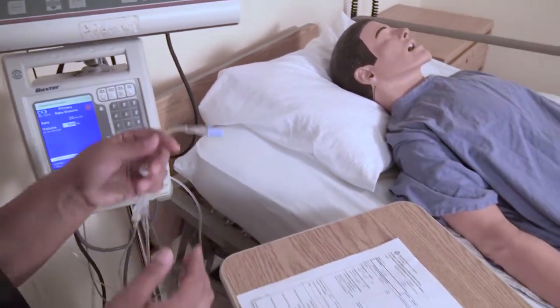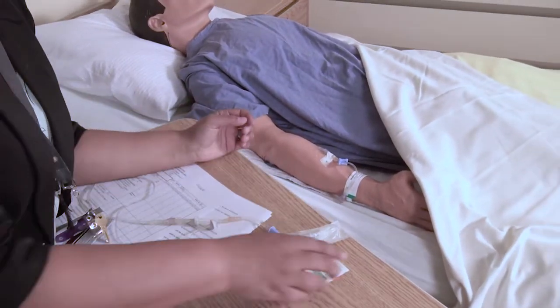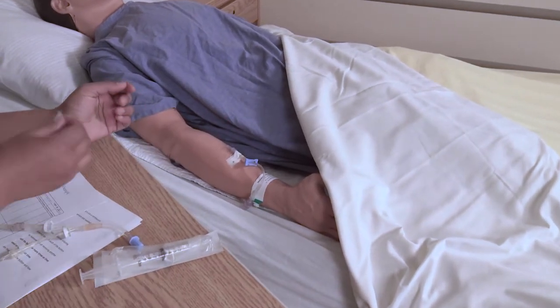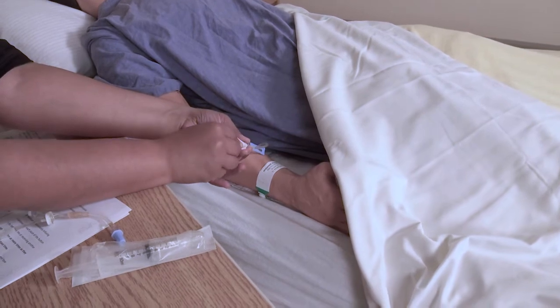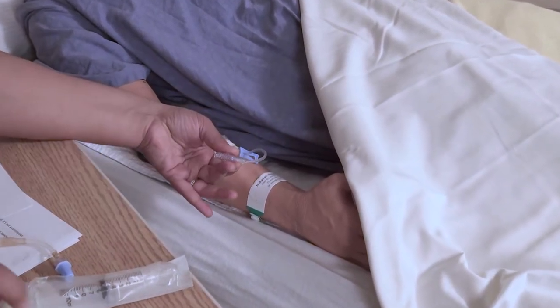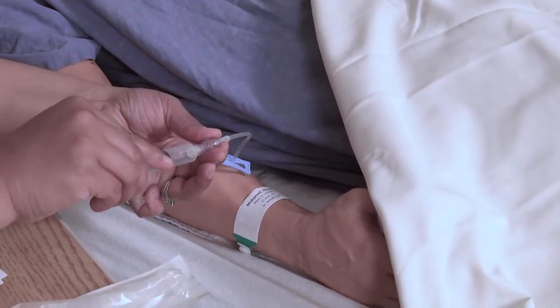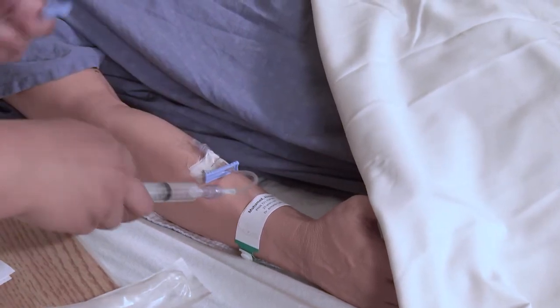So we're going to come to the patient and clean his IV site. And then you're just going to flush as you would normally with any new site, just to make sure that it's patent.